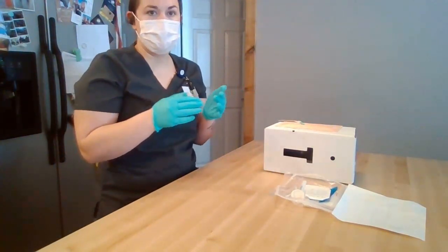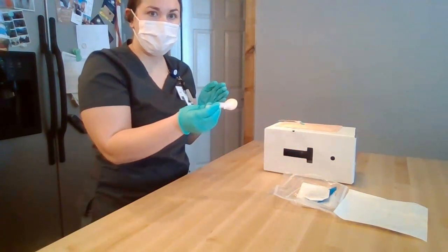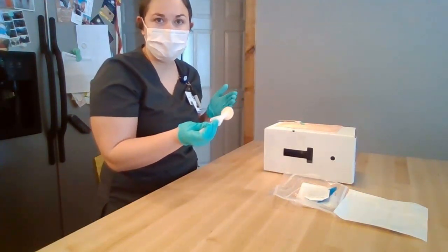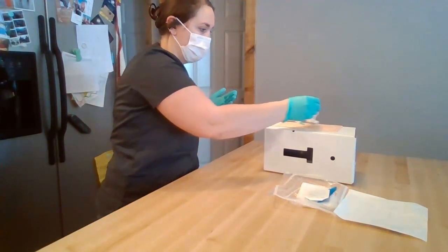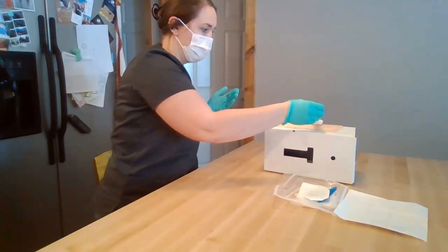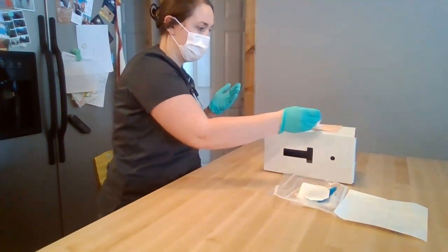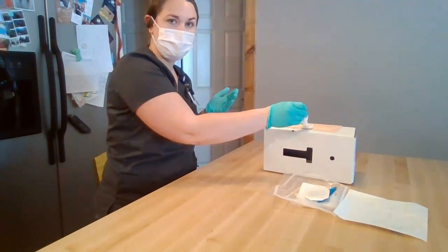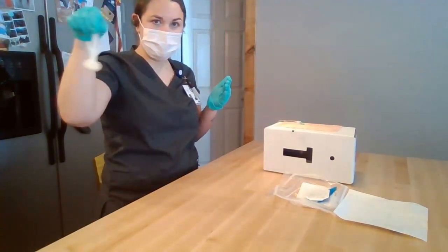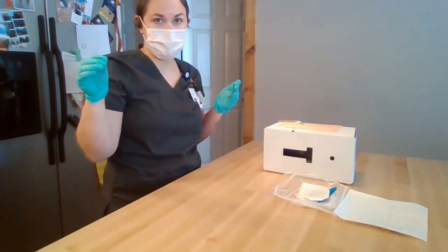Now that my hands are sterile, I can begin cleaning the area around the catheter. I'm going to get out my chlorhexidine wash and scrub with a back-and-forth motion for 30 seconds in a square motion, making sure not to go over areas I've already cleaned and to do the tubing last. I'm going to make sure the area I'm cleaning is the same size as the dressing I'm using, then do the tubing last, and discard this in the trash. Once discarded, I'm going to let this completely air dry for 30 seconds.